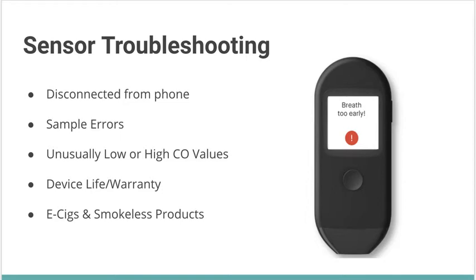And if that still doesn't work, there are still some reasons why the user may not be getting that sensor paired. For instance, their Bluetooth could be turned off, their battery could be low, and in some rare cases they may need to reset. But all of these are going to be provided in the FAQ, so you can provide those direct links to the users. And again, all of these tickets will need to be filed to tech support, for FDA purposes for our records.